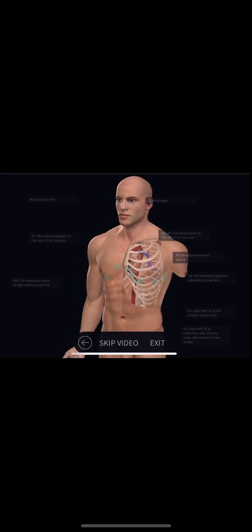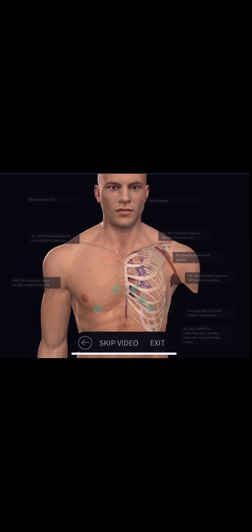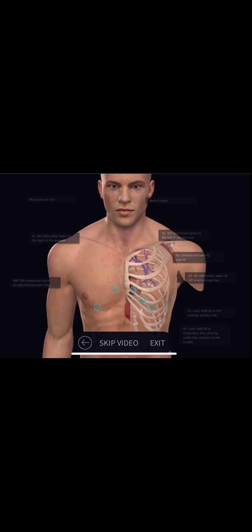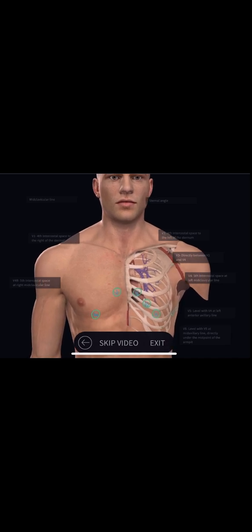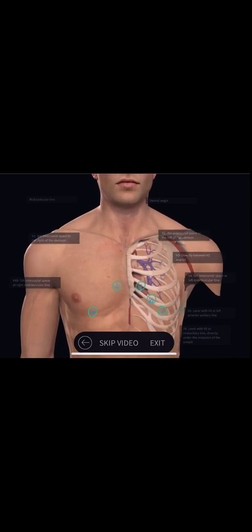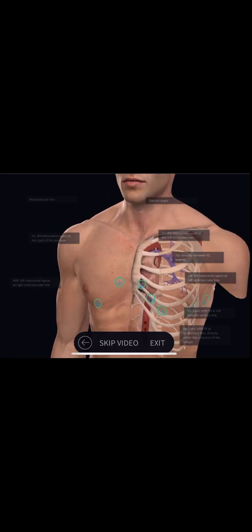To get information about the conducting capacity of our heart, a physician needs to be able to read the electrical output of the cardiac tissue, and this will be done through placements of electrodes and EKG leads. The electrode is an actual metal plate positioned on the surface of our skin, and that will be used to detect the electrical currents of the heart.